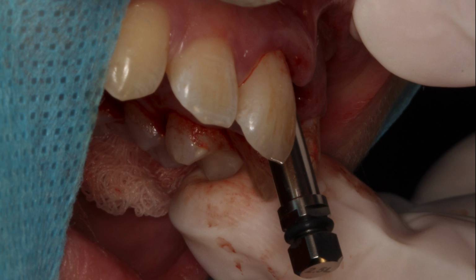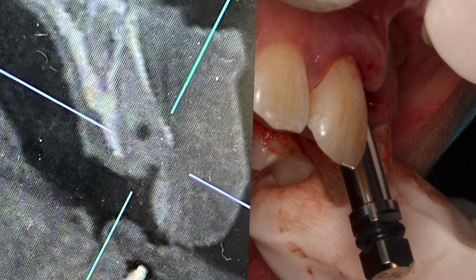When the osteotomy was done, the long axis was lingual to the incisal edge. But as the implant was placed, it actually ended up right at the incisal edge. So what did happen? Well, let's try to understand this schematically. This pink represents the initial osteotomy that we worked very hard to get. We worked on the slant. We worked with a number of drills, piezoelectric surgery, and so forth to get that anchor point, and we drove in the small diameter twist drill until we got to the final twist drill.